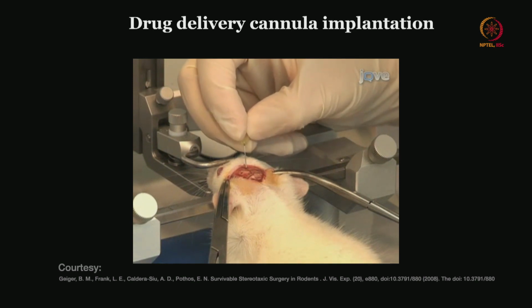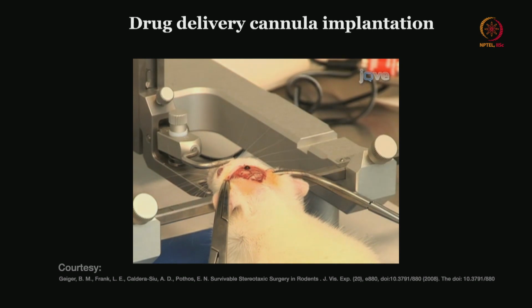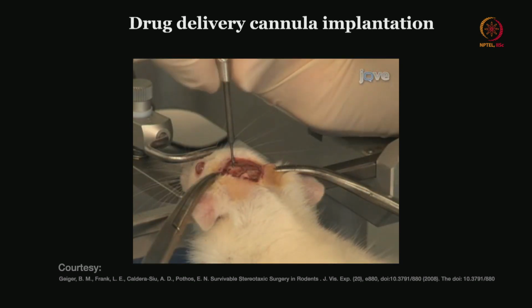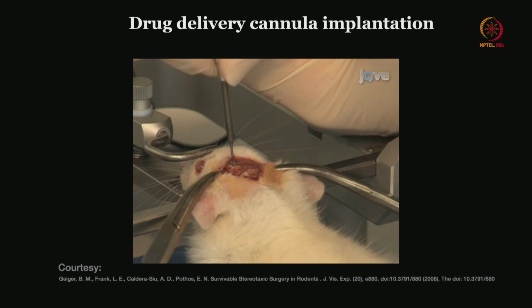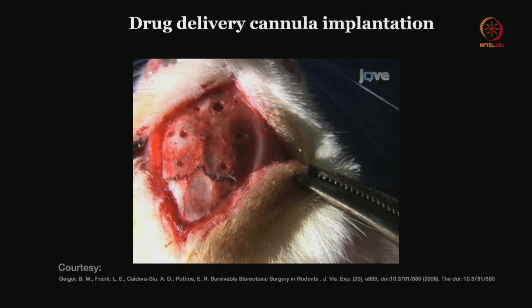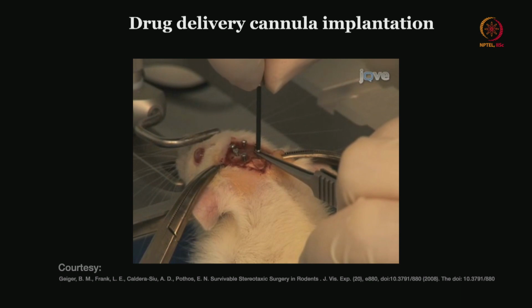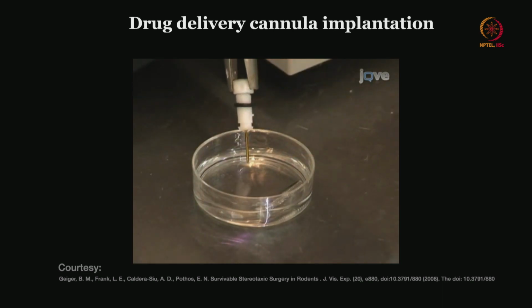So once you make sure the dura is not punctured, what you saw now is basically how they puncture the dura and see either a drop of blood or CSF come out, and those 4 holes we just discussed are for the screws to give us the good rigid fixation. Once those extra burr holes are made, the screws are implanted as shown here.